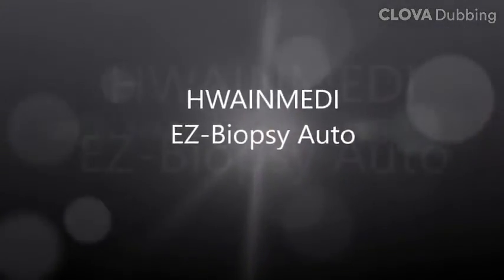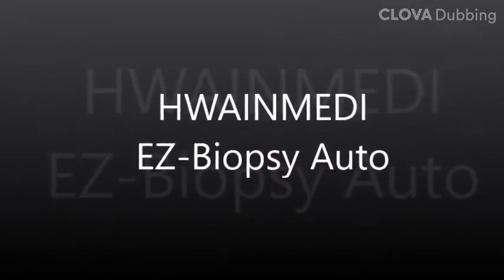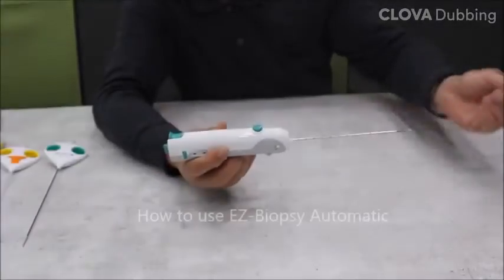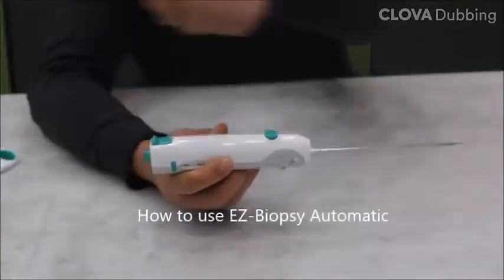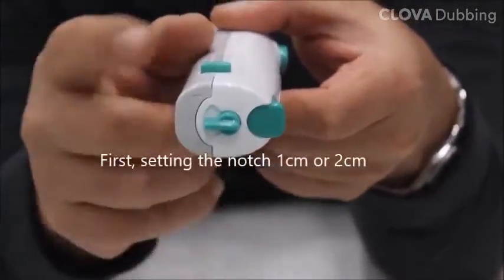HWAINMEDI is a company specializing in R&D and manufacturing of medical devices. The purpose of EZ-Biopsy is to collect tissue samples from a diverse range of soft tissues for biopsy. This is all about how to use EZ-Biopsy Auto.